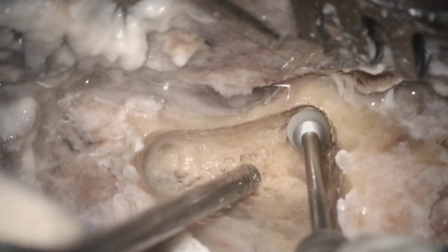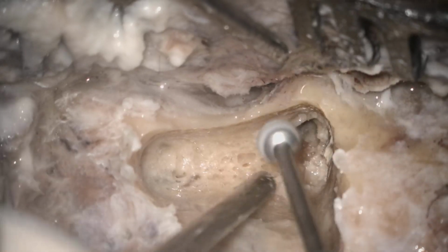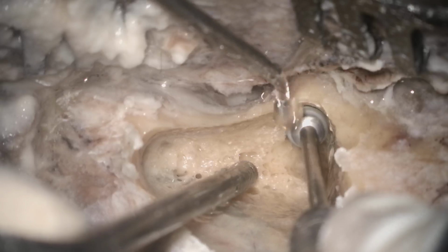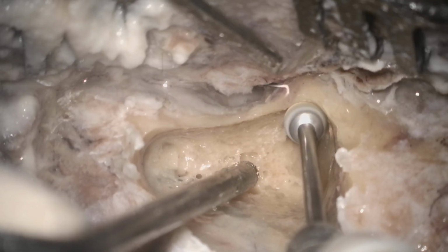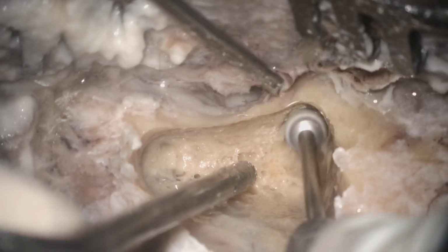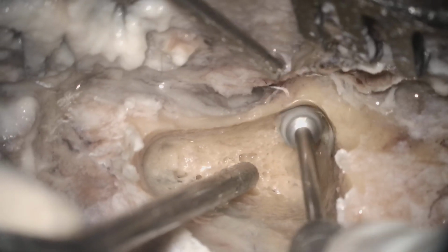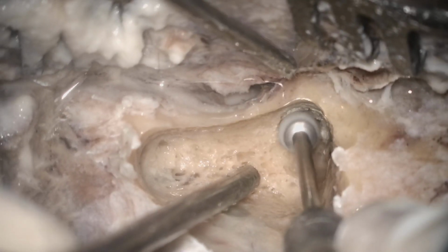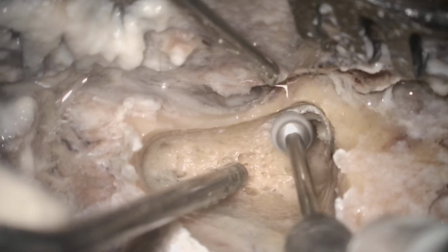So you will remove the bar, and now you have to drill up to the incus. You have to identify the incus, because this is one of the valuable landmarks here. If you do not identify the incus, then you should not go for the facial nerve or posterior tympanotomy.